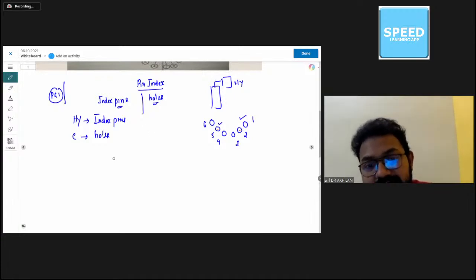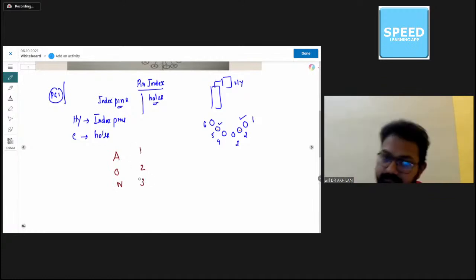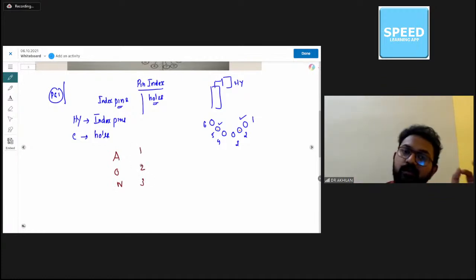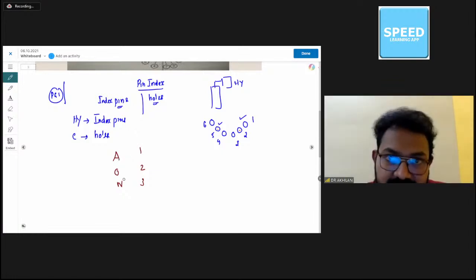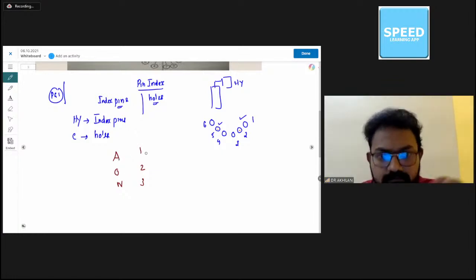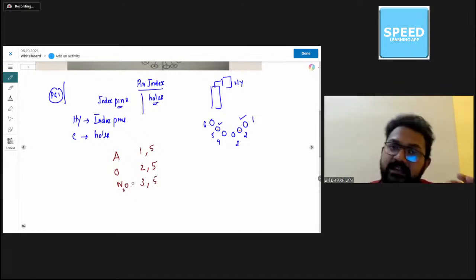Okay, so first write down AON 1, 2, 3. Okay, write down AON 1, 2, 3. So A is air, O is oxygen, N is nitrous oxide. Air has a pin index of 1,5. Oxygen has got a pin index of 2,5. Nitrous oxide has got a pin index of 3,5.